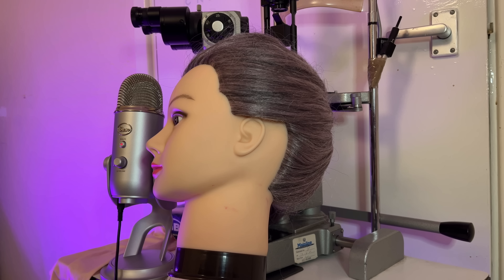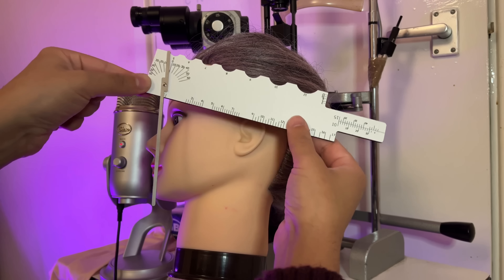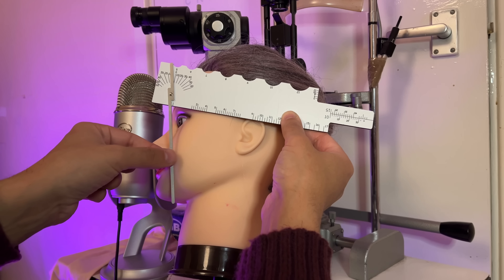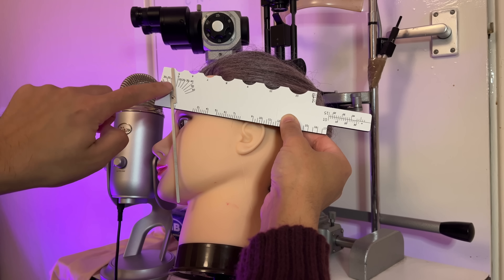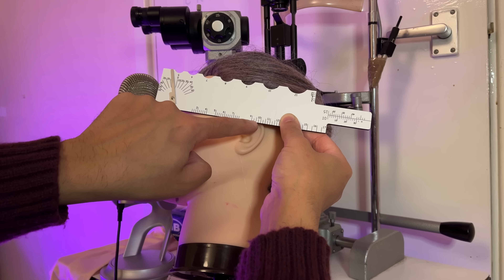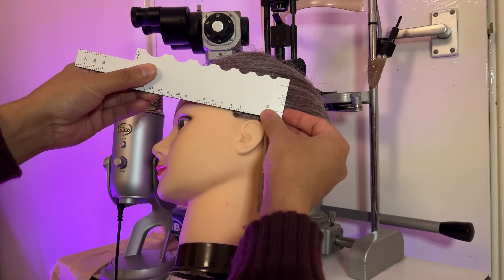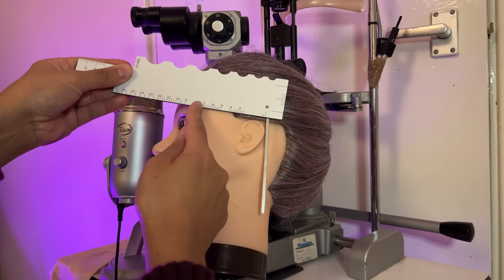Right, now we're going to try length to bend and angle of side. I have the scale here — we want it like so, at the top of the ear, with this part just above the patient's eye. Bring the cursor in so it's against the eye, take the angular measurement there, and the length to bend shall be from the top of the ear. Marvellous. Then for length to tangent, place the ruler here — this will go behind the ear — and take the measurement on the scale to the front.